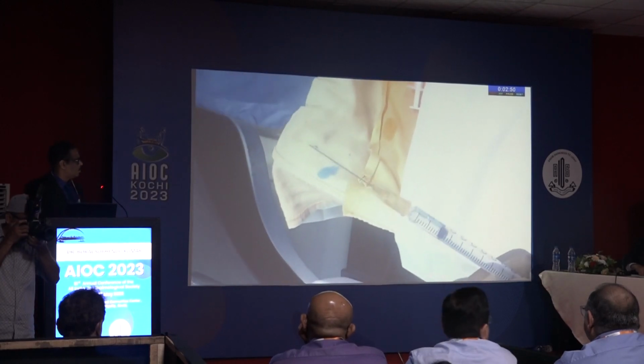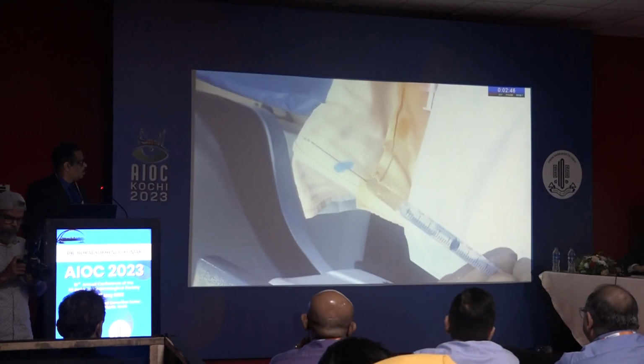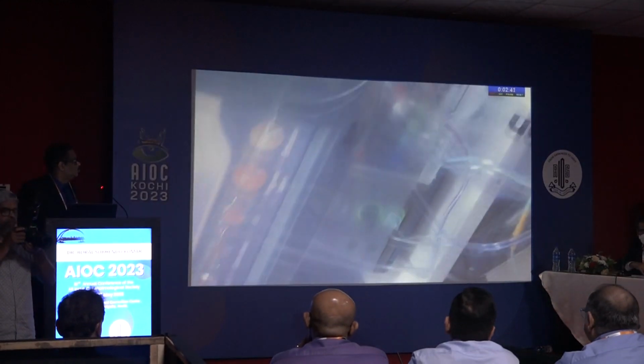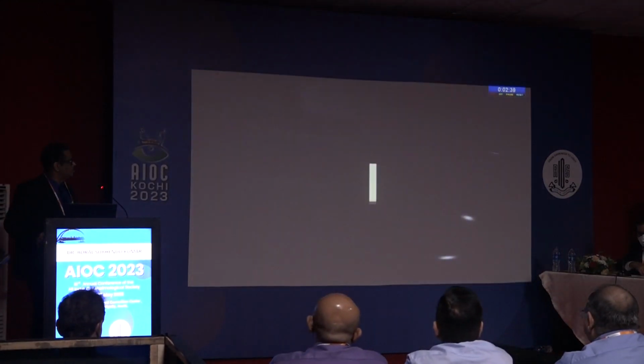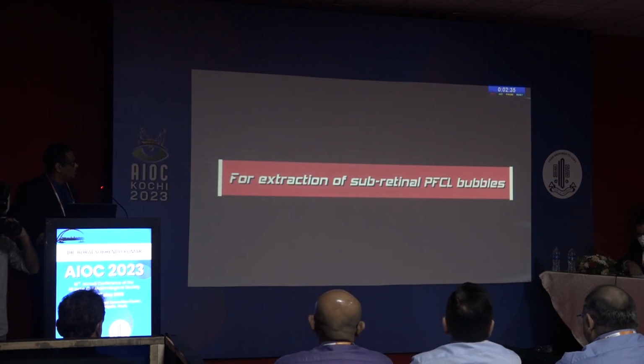Here the cut rubber tip of the plunger can move smoothly within the 1 ml syringe during injection or extraction mode of the VFC. We named it Micro VFC. Firstly, the practical application for extracting the subretinal retained PFCL bubbles.